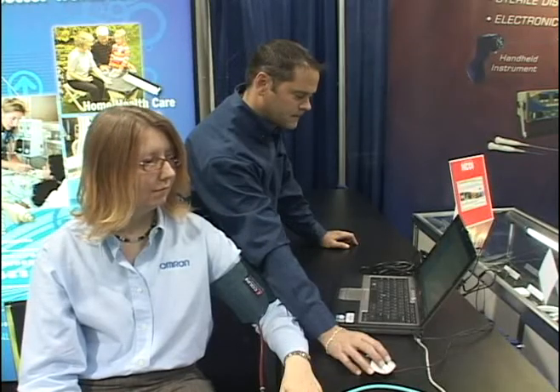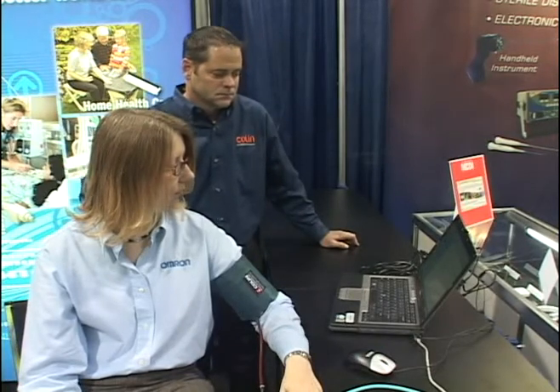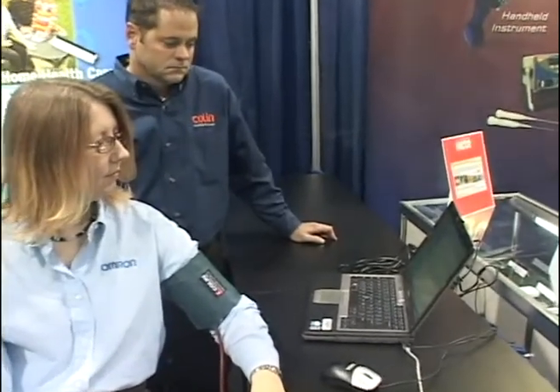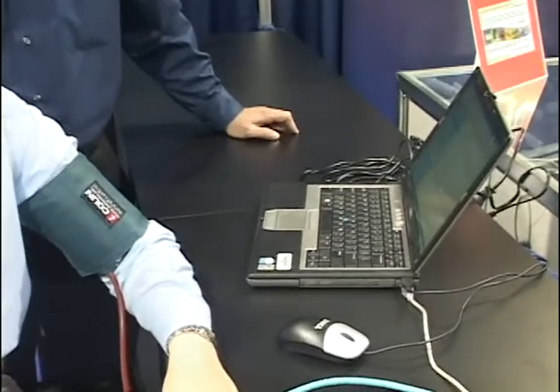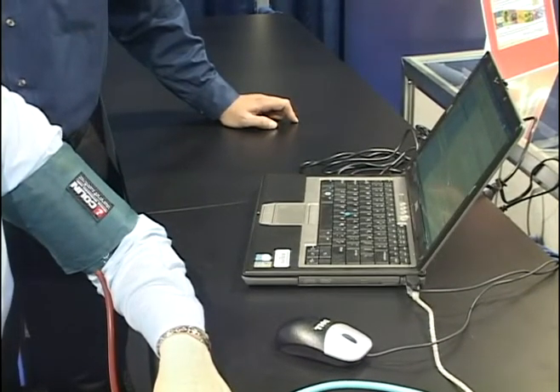What you're looking at here is our developer's kit. This can be connected to any PC. We have some scripts that we include as part of this developer kit. What you're seeing now is an actual blood pressure measurement being taken with just the module alone connected to the USB port of a laptop.